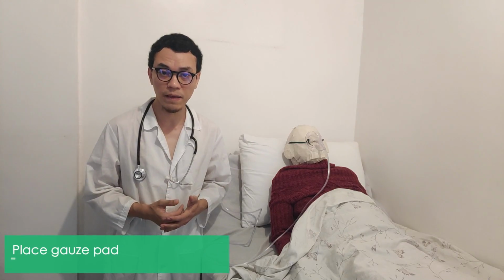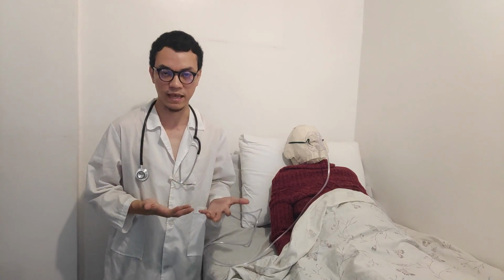Next is, if the patient reports irritation or redness is noted, place a gauze pad under the elastic strap at the pressure point to reduce the irritation on the patient's ear and scalp.